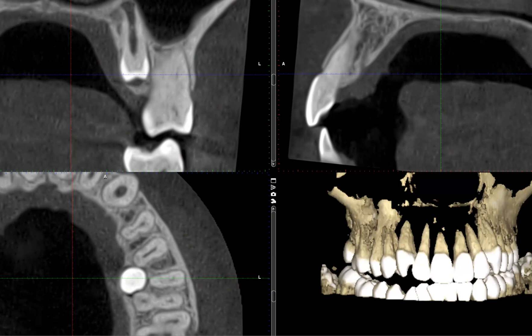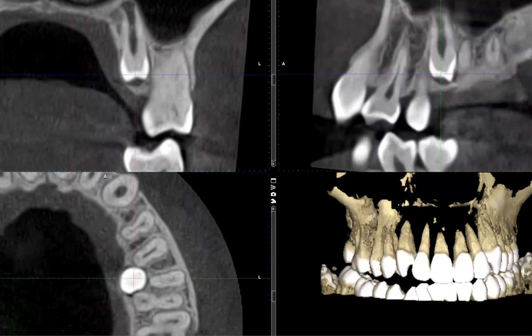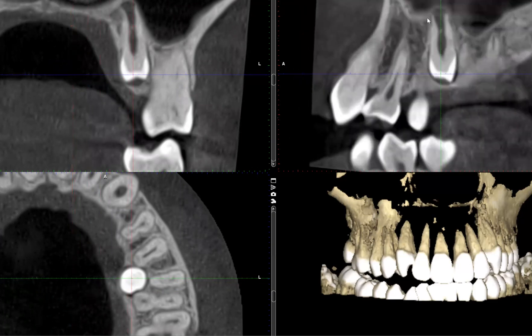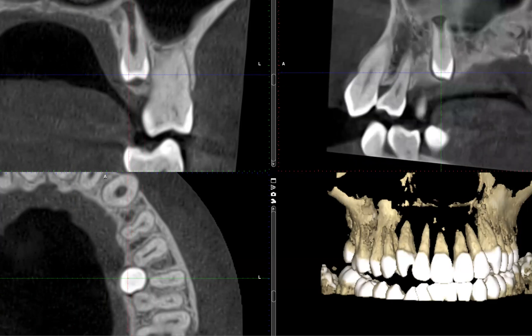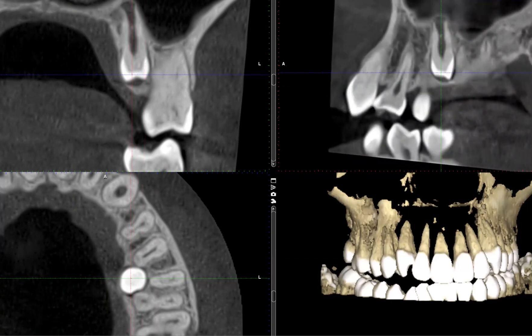The root apex is extending somewhat into the maxillary sinus. When I say into, it's not literally into the maxillary sinus — the floor of the sinus is still intact — but you can see that the shape of the sinus floor has been altered as a result of this impacted supernumerary.